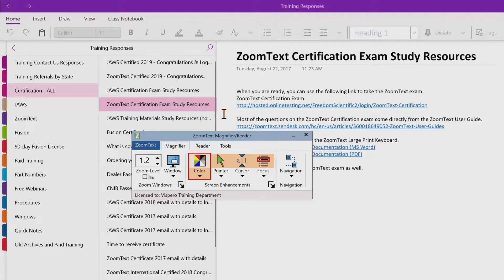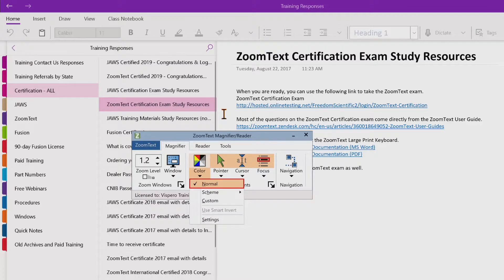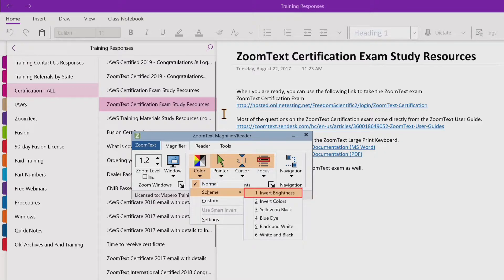To choose a preset color scheme, on the magnifier toolbar tab, click the arrow next to color, and in the color menu, choose the scheme submenu. In the scheme submenu, choose the desired color scheme.